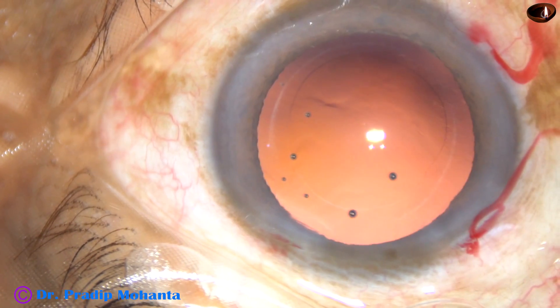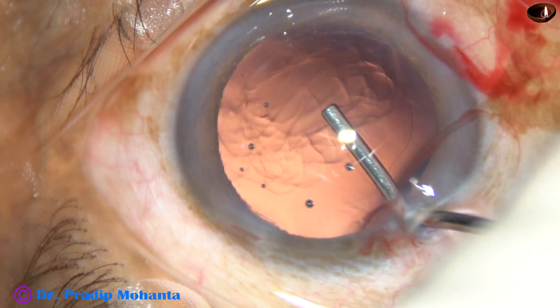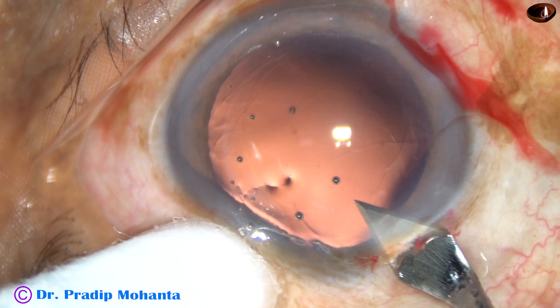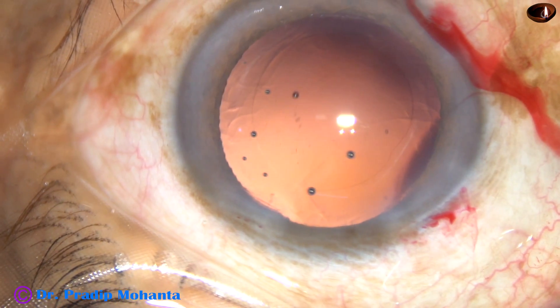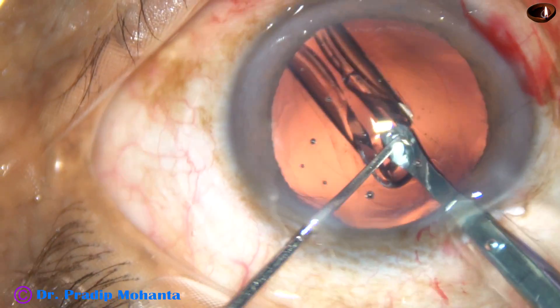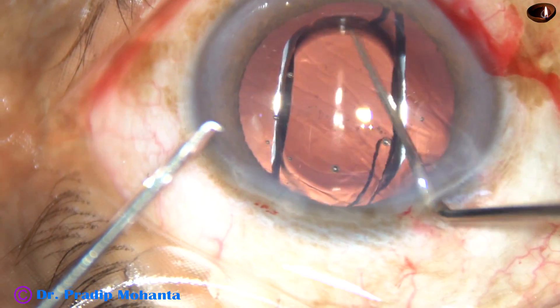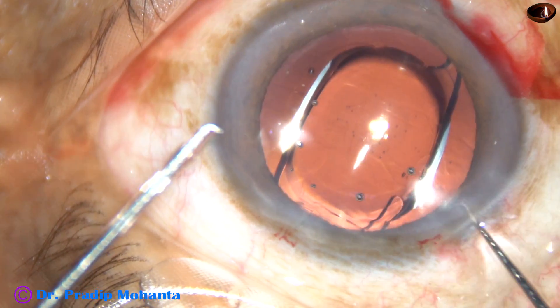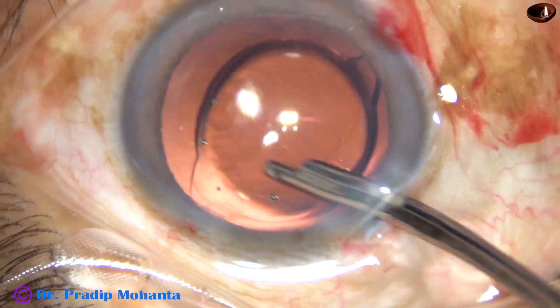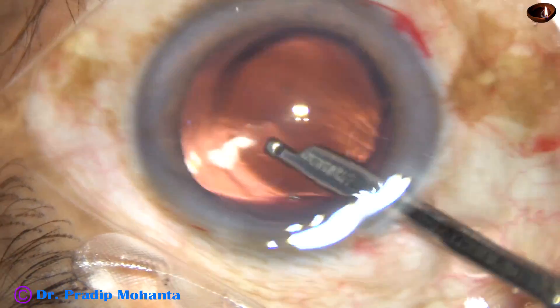In this case, I am going to use a hydrophobic acrylic aspheric monofocal intraocular lens, and I am going to use a B cartridge. Because I am using a B cartridge, I will enlarge the main incision by 0.2 mm, so it becomes 3 mm. This is the Tecnis 1 from Abbott Medical Optics — a very good lens. I like it very much because there is no glistening even many years after surgery. Acrylic lenses from Alcon develop glistening over the years.